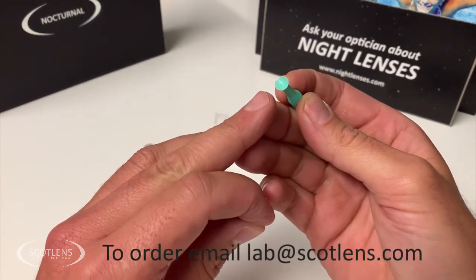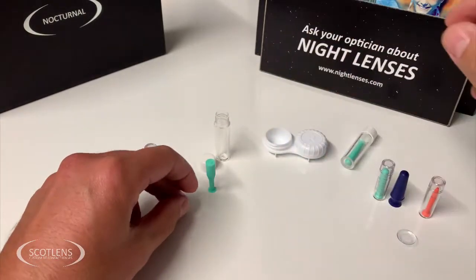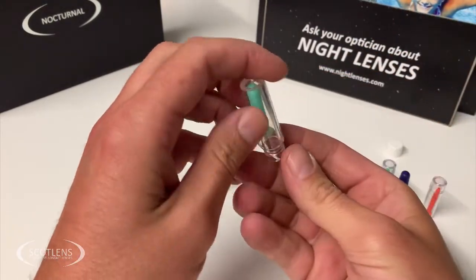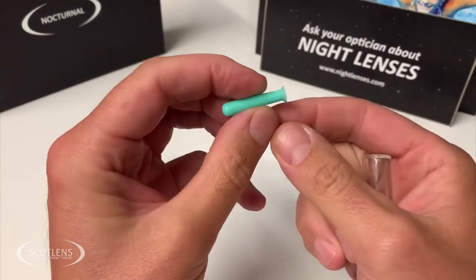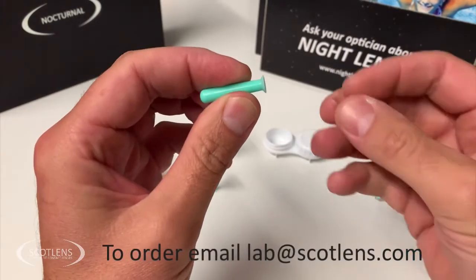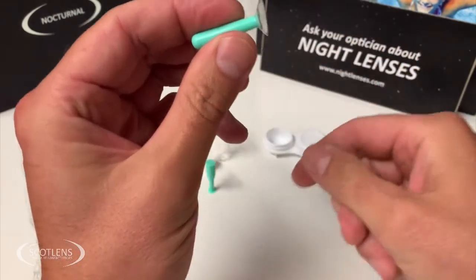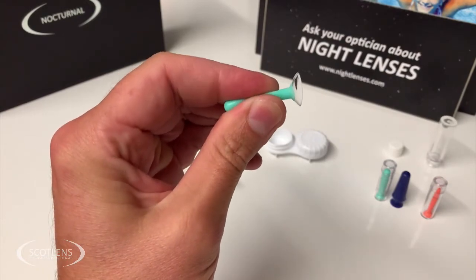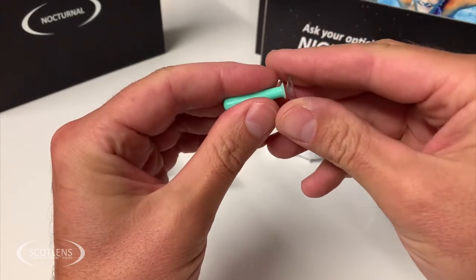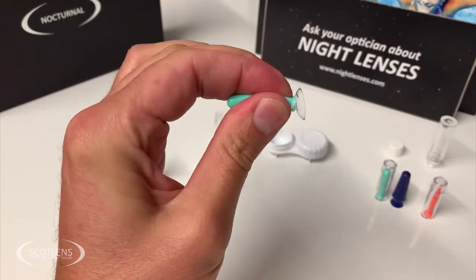Solid suckers can't be used to apply contact lenses — this is when you need a hollow style sucker. You can see here this one is a hollow sucker. These are generally used for larger scleral type lenses. You squeeze the sucker, apply it onto the contact lens, and then by squeezing the sucker it will release the contact lens onto the eye.